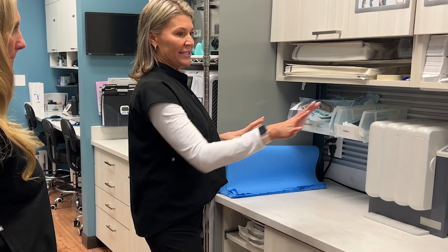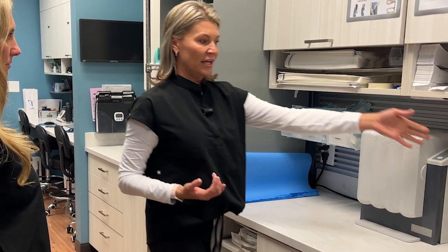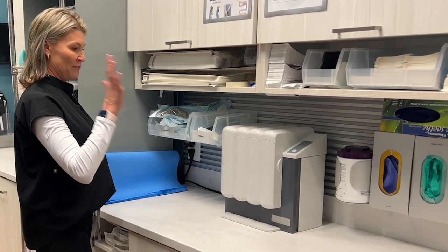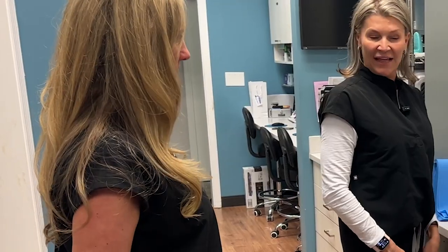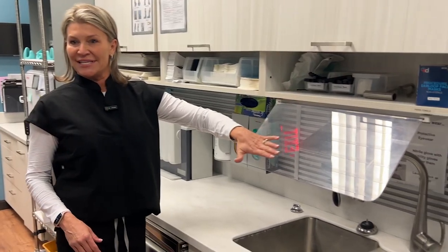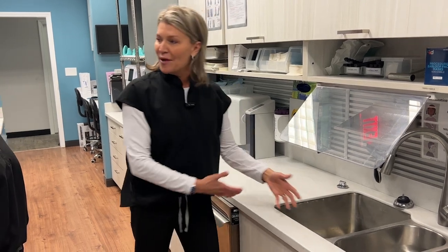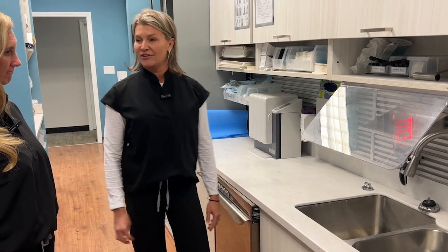The slat wall has been huge for us in the operatories. We've added it back here to accommodate things like wipes and gloves and all those things that would typically just bombard your countertop. This really uses the space and gets it all off the counter. And look at this — this plexiglass shield. No one's getting splashed in the face. If you accidentally drop your cassette into the sink, you don't have to worry about anything splashing in the face.